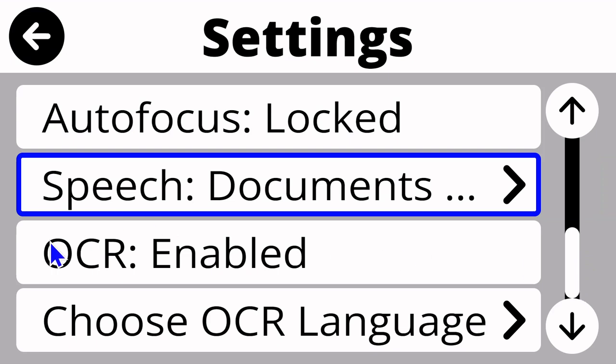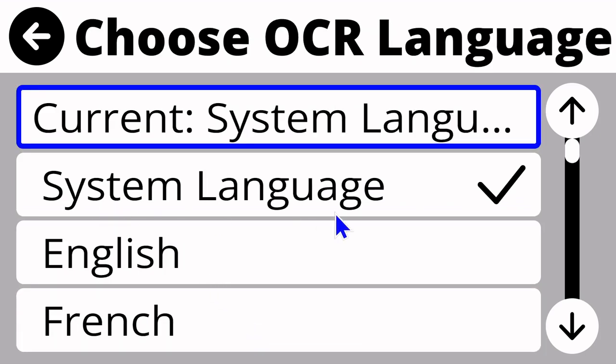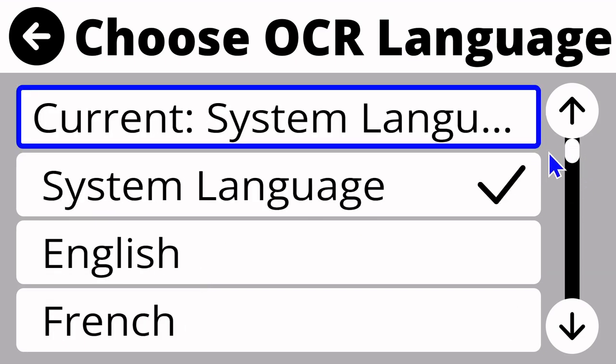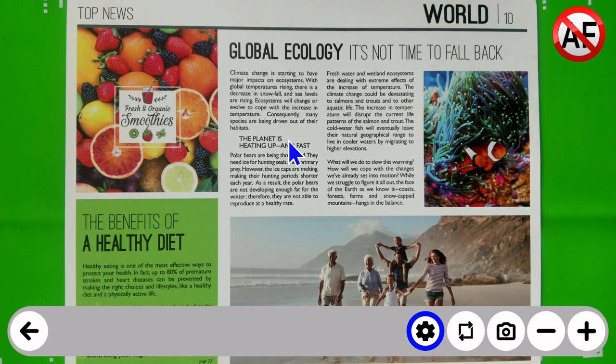Continuing down, I have my optical character recognition, or OCR, enabled right now, and we're going to go ahead and leave that in place. And then if you'll recall from back when I quickly showed you my magnifier a few moments ago, my document is in English, so let's make sure that our system language is in fact English. You've heard it speaking already, so we're good to go with that. If I had a French document, another language, I could scan down here and change to another language before I perform my capture. So we'll just leave it on system language for now, and we'll use our back arrows in the upper left to come back out to our document. And again, remember, we are in a live mode.